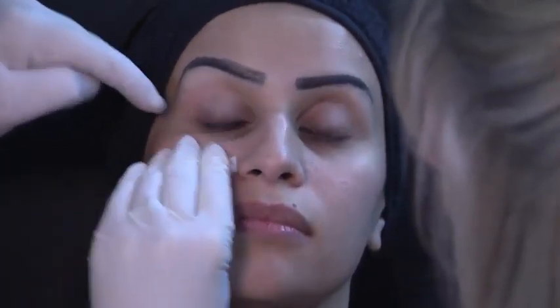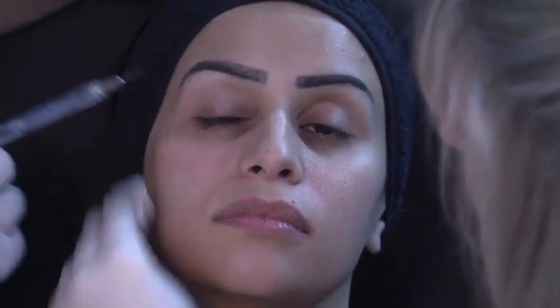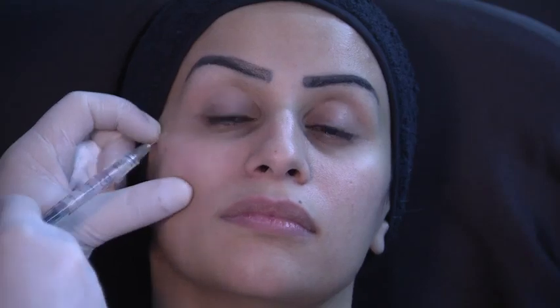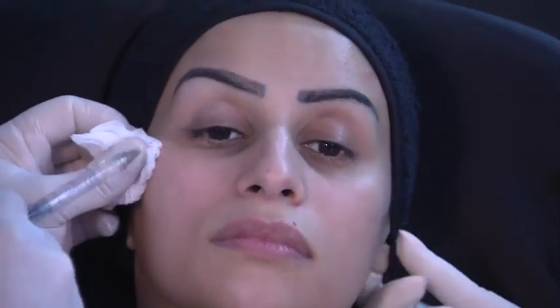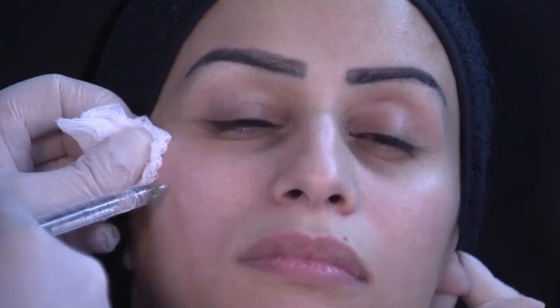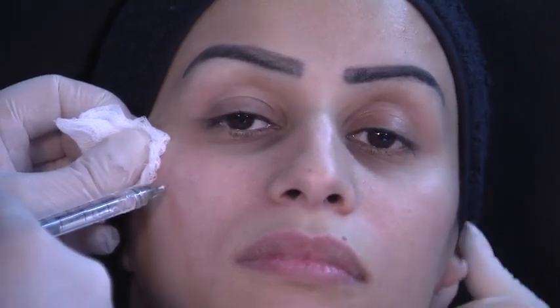Okay? Second point, can you disinfect? Okay, 1 centimeter lateral to the canthus and 2.5 below, more or less as a reference. I'm going to stretch the skin, going completely perpendicular, and I touch the bone. This is the point of maximum projection.